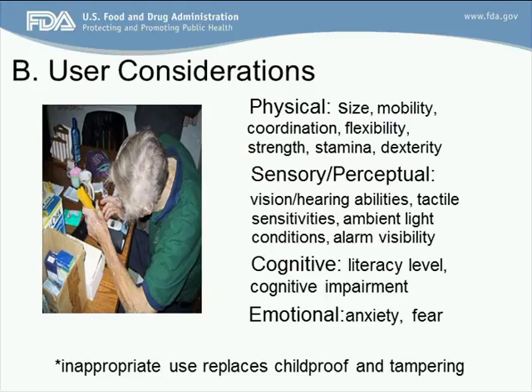So here we had a physical where you're looking at possibly a 75-year-old woman taking care of her 80-year-old husband in their home, and she has to have the strength and the stamina to be able to lift him, let's say in that patient lift, and move him from his bed to his chair and back without tipping him over, without her falling over, and without him falling out of the lift. So thinking of all the size, the strength, the mobility of that particular individual.